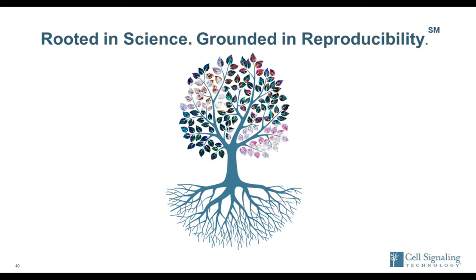Chris, I work in a preclinical setting with a lot of mouse models. Can you describe how to get around mouse-on-mouse cross-reactivity issues? Sure. As I mentioned with our mouse reactive panel, most of our primary antibodies are raised in rabbit. So when you're using rabbit antibodies in mouse tissues, you won't see any mouse-on-mouse reactivity. I know a lot of other companies are raising their antibodies in mice, and that's going to lead to issues with your mouse secondary reacting with IgG within the mouse tissue. But when you're using rabbit antibodies, you won't run into any mouse-on-mouse reactivity.